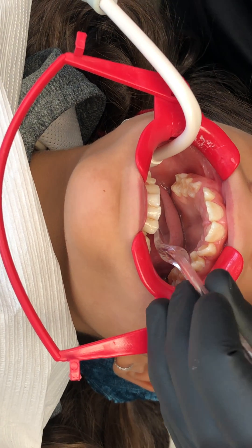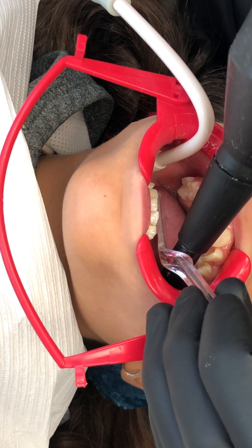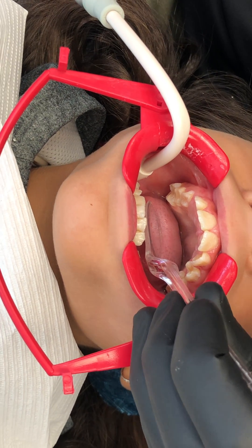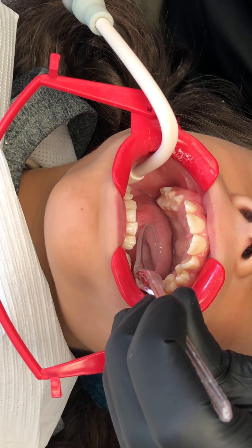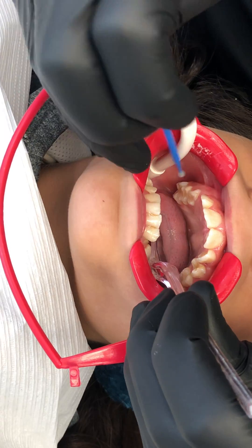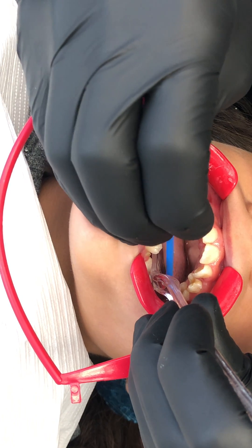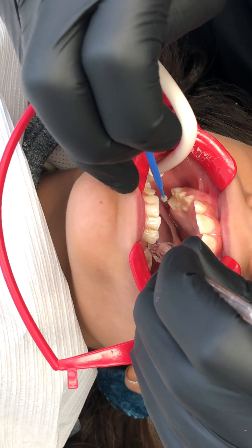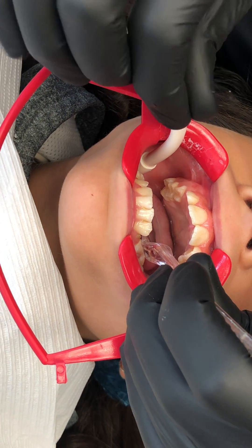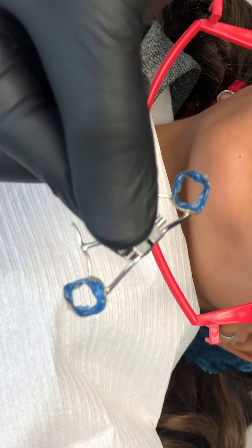Now we're going to paint our primer — the Assure — on the teeth. We'll paint it on the lingual and buccal surfaces, and go over the occlusal a little bit as well, since the band wraps over the occlusal.